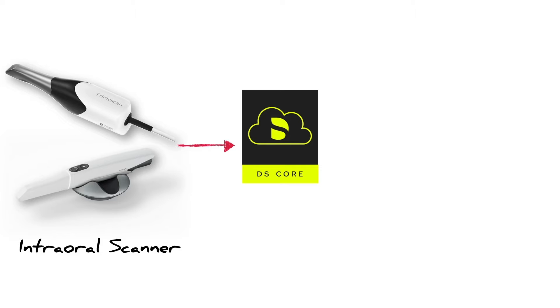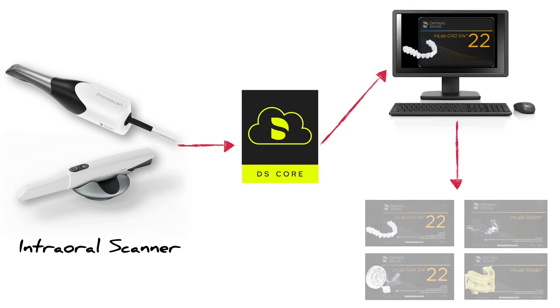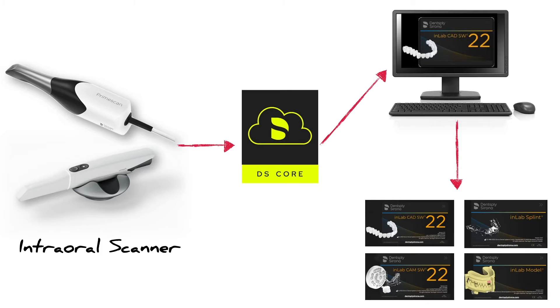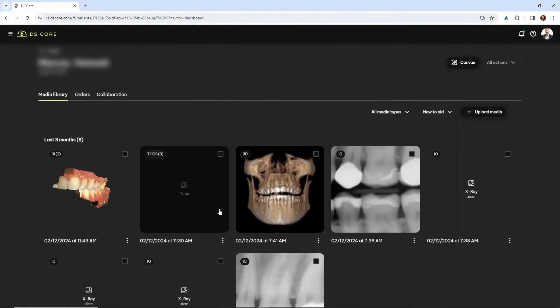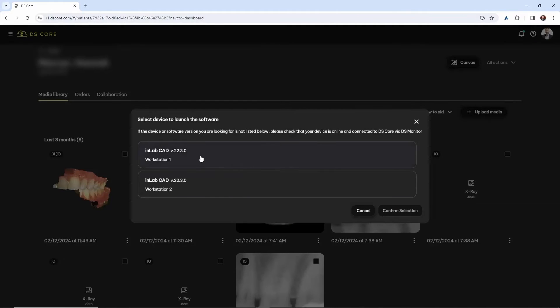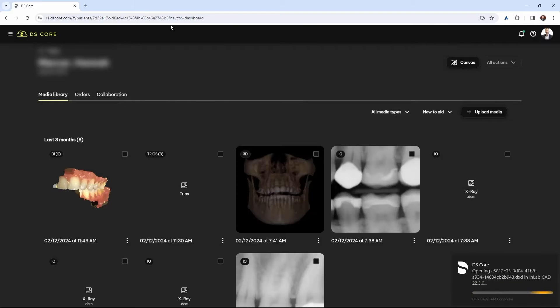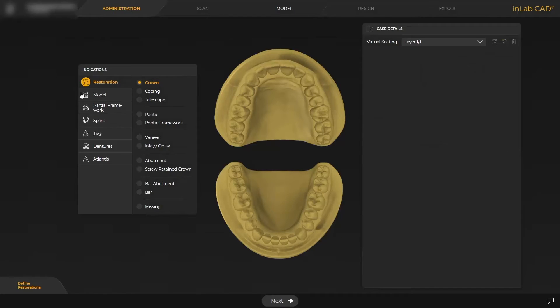This is really the best part of integrating the TRIOS scanner into your office — you have accessibility to the open in-lab software in every module needed to mill or print a restoration or part. You simply send the case to the in-lab software directly from DSCore, and the in-lab software will automatically open up on your workstation so you can start the design process.